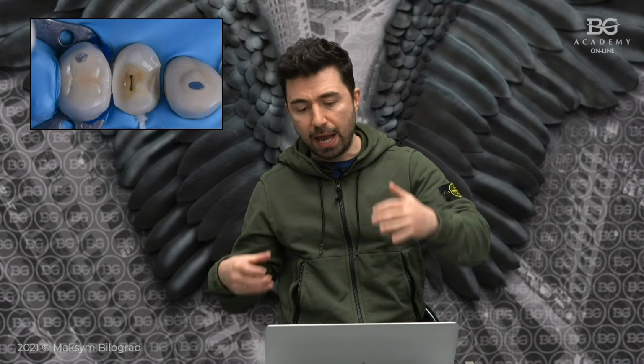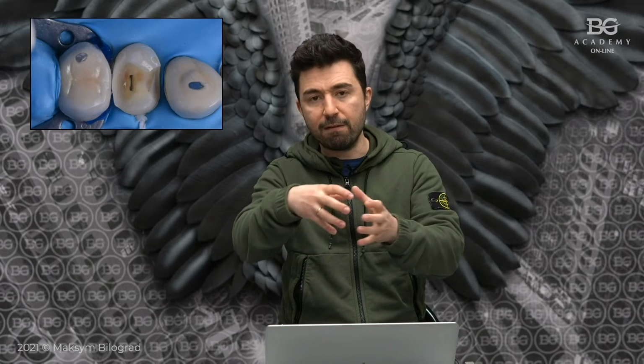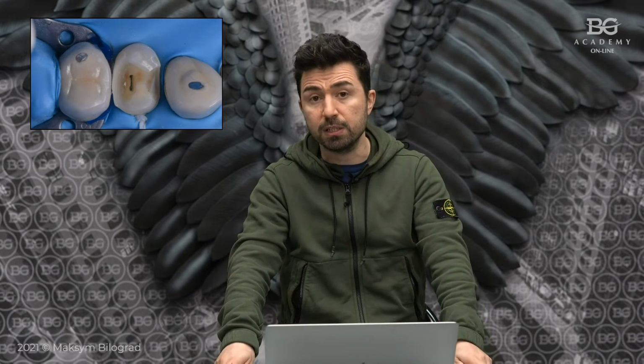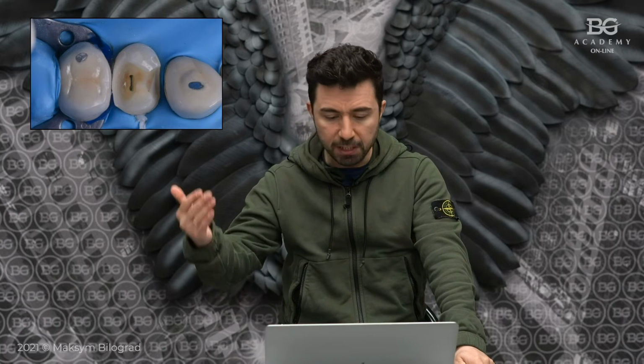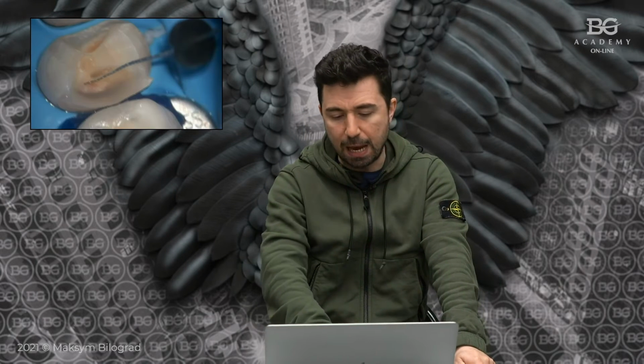Okay, that's why I just put a matrix and, with no bonding, restored the wall. When I am doing root canal treatment, I will have good conditions for irrigation. After my endodontic treatment is finished, I will just break this wall out and I will get my enamel again for indirect restoration. So let us see the next steps of the treatment.